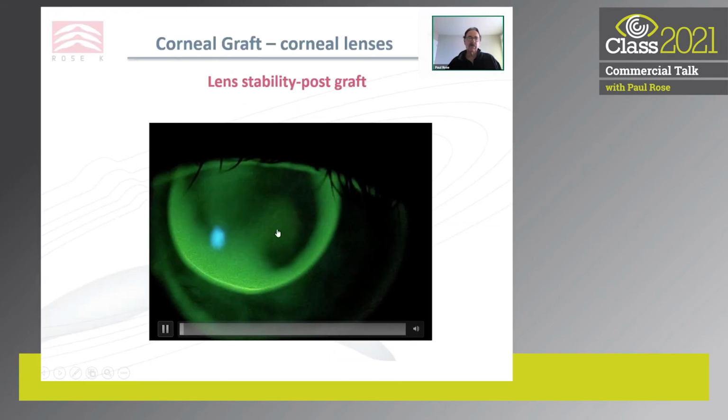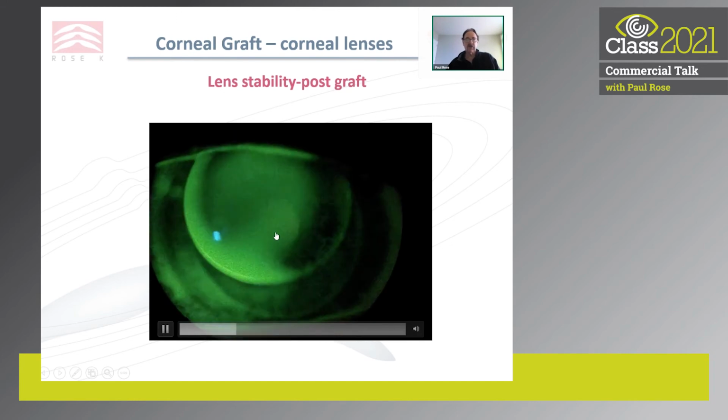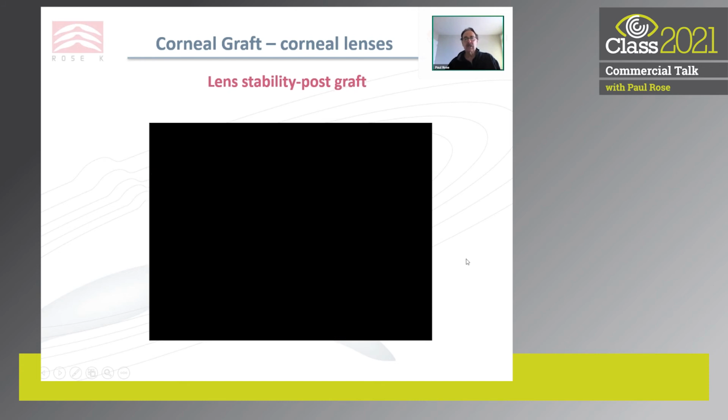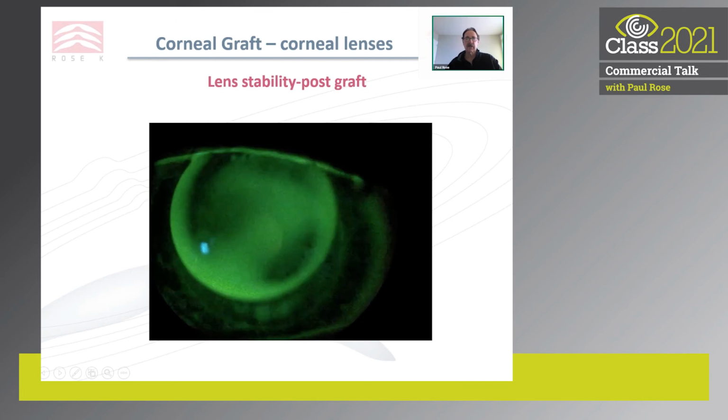And sometimes, even if you get a good fit and central position, this is a post-graft Rose K, the patient looks sideways and the lens dislocates. So stability can certainly be a problem with some post-graft fittings.